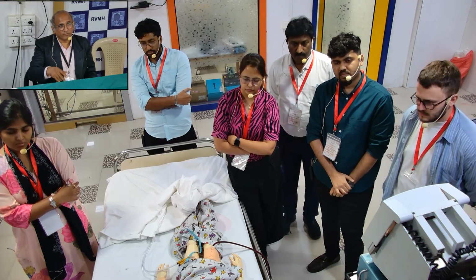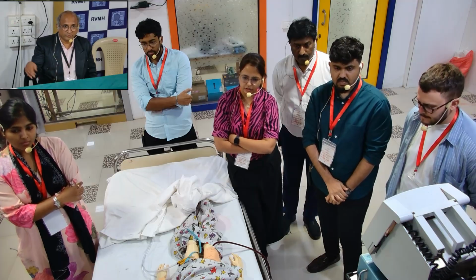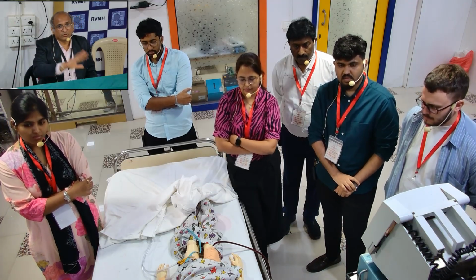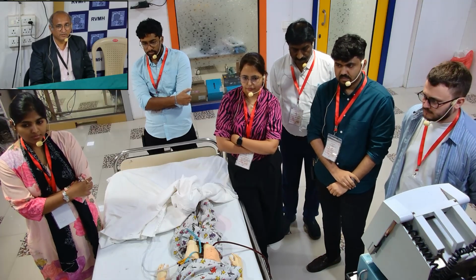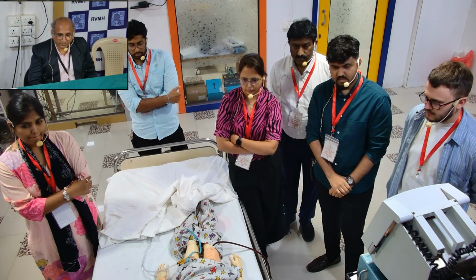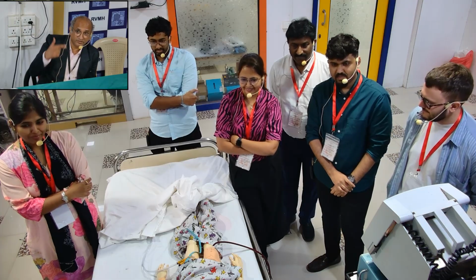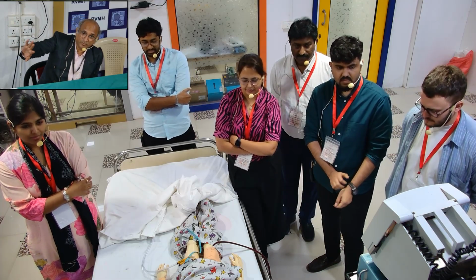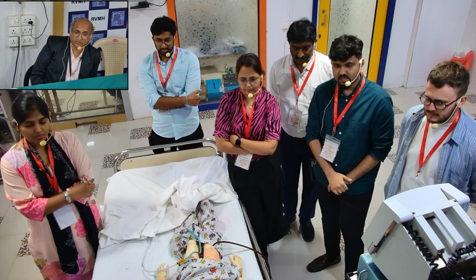But how will you confirm? You connect it to the bridge, open the bridge, and circulate. If the circulation is going well in the bridge, that means the circuit is okay, and something is wrong with the cannula. That is the way you will be able to diagnose. Okay. Fine. Anyway, you picked it up at the last minute so that the patient didn't go into arrest, and the response was also immediate. Within 20 seconds, saturation has come up and heart rate has come up. All circuit pressures, everything got normalized. That's because it was just a kink. You relieved the kink, and the response was immediate.